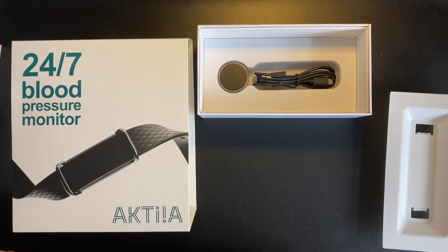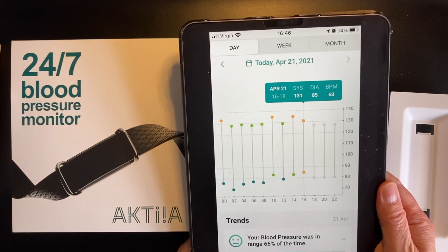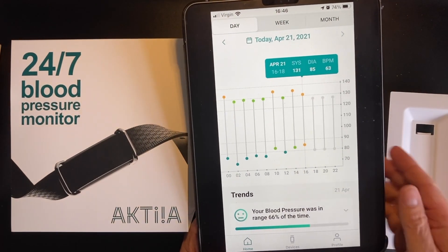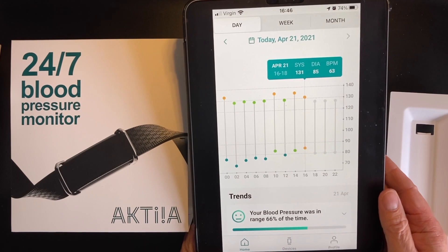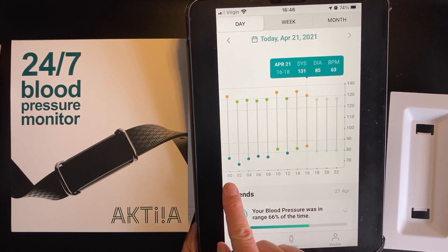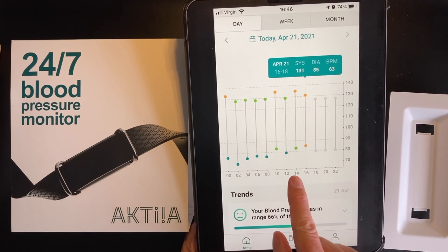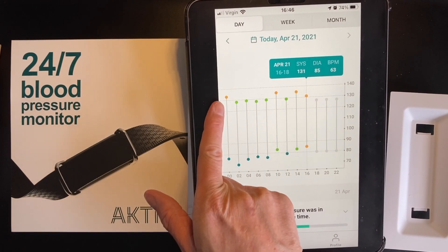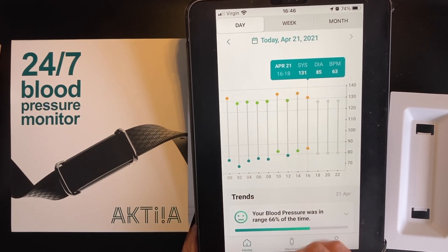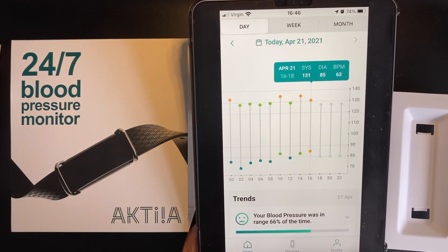When you wear the device, you get data throughout the day. Here's a screenshot on my iPad showing how this works — this is my actual data shown on the iPhone app. You can see it averaging data every two hours, with the top line representing my systolic blood pressure and the lower one representing my diastolic blood pressure.